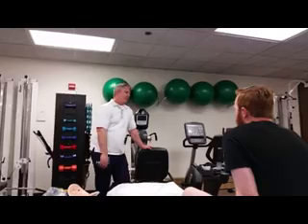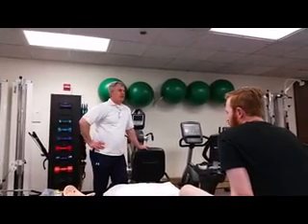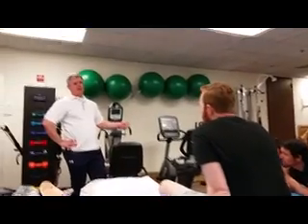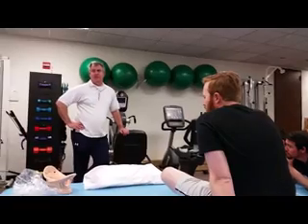So first thing you do is you come in, Teresa, hey, I'm your PTA today. We're going to put this new cervical brace on so you can sit up and do stuff, but I'm going to raise the head of your bed up a little bit. Is that okay? Yeah. How's everything doing? Okay. Let's put it on. It's easier to put on. It's easier to adjust.